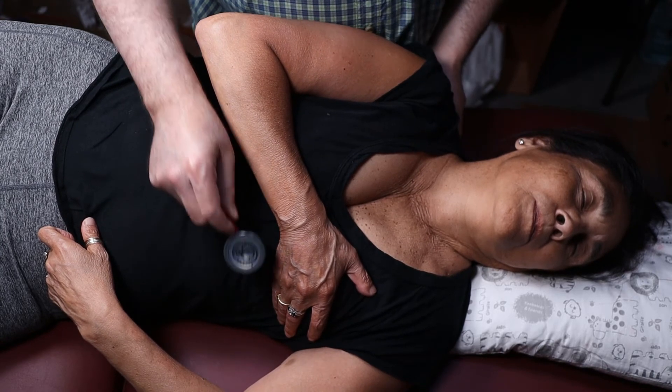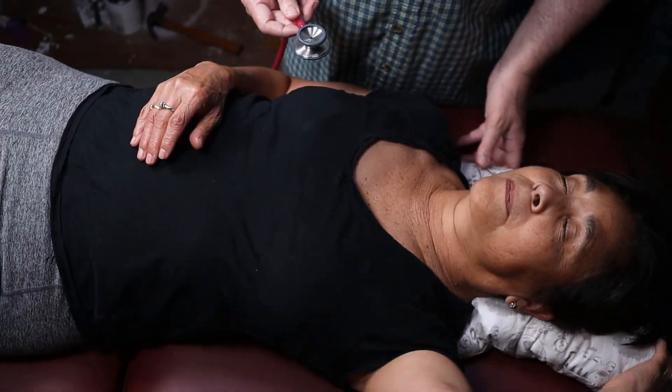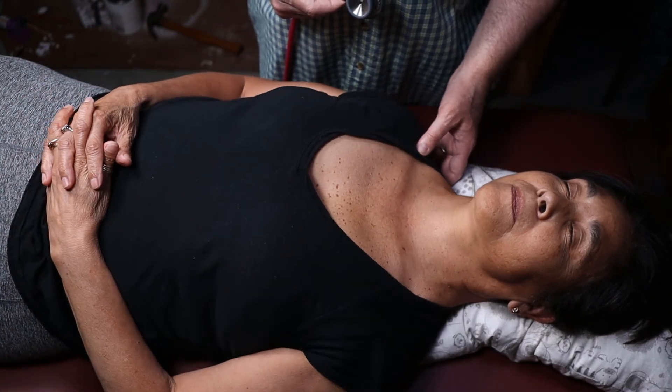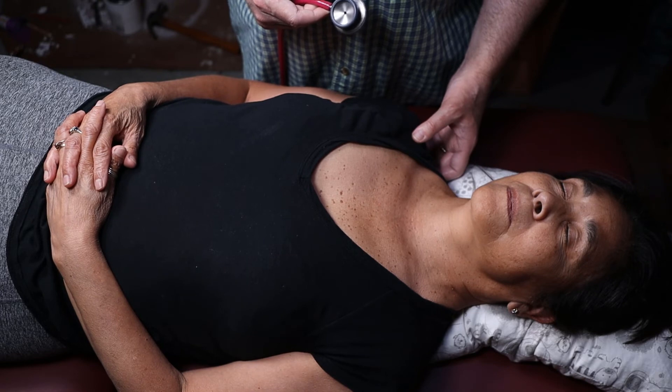What's the S3 heart sound? That's Kentucky — long, short, short. Like a galloping horse. It's called the ventricular gallop. I talked about that in the video.